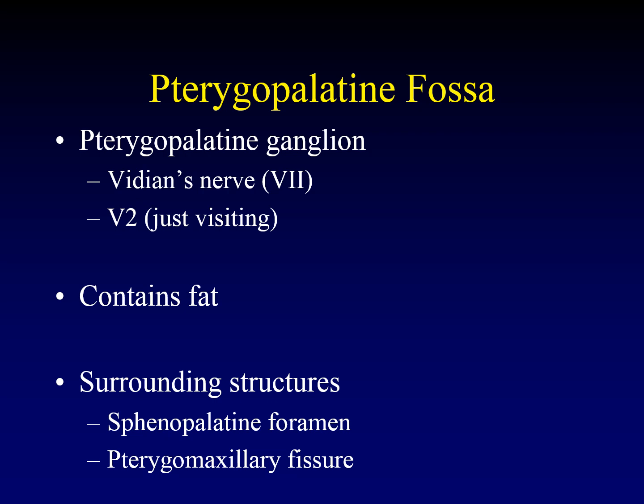One of the most important things to understand about the pterygopalatine fossa with respect to imaging is that it is predominantly composed of fat. Yes, there's a ganglion and nerves in there. Yes, there's a sphenopalatine artery and some accompanying veins running through there. But the dominant thing that you find in the pterygopalatine fossa is fat, and we're going to use that fat to our advantage on imaging.